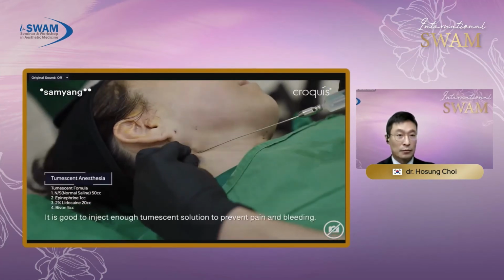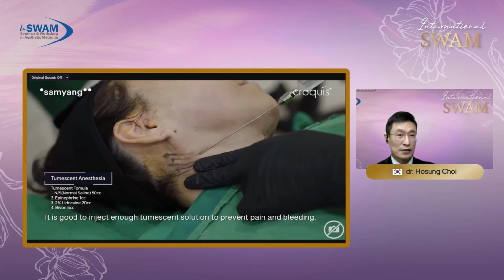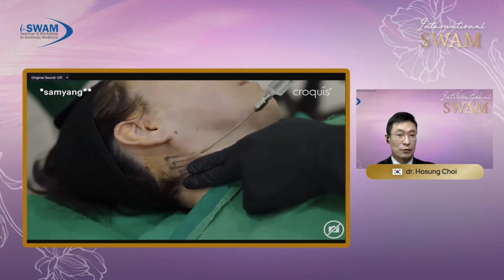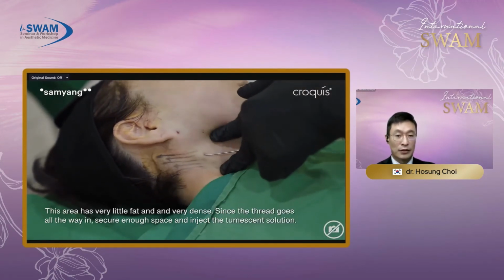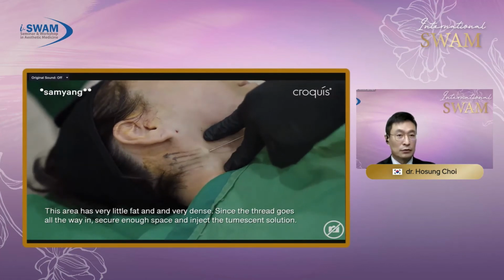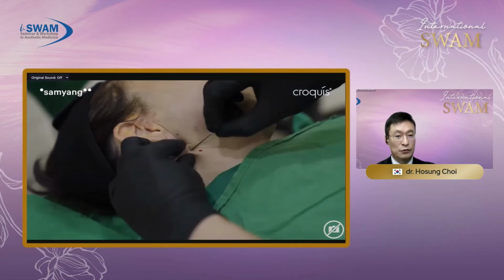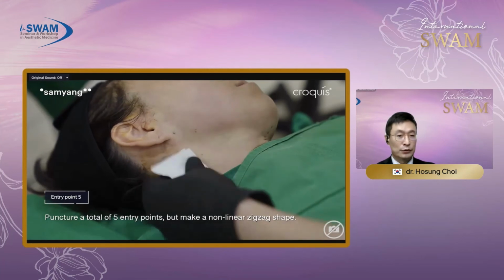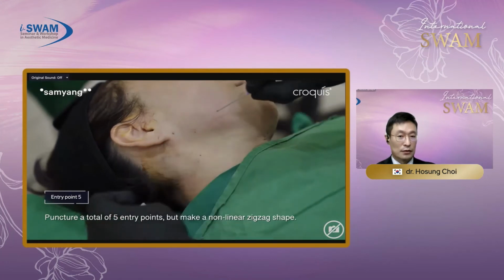Okay, the last part, I'm performing the occipital lifting technique. The skin in this area is relatively dense and tightly attached to the fascia. So it's sometimes difficult to advance a blunt cannula. So you should be very gentle and very careful when inserting the threads or the tumescent cannula for tumescent infusion. This tumescent infusion is quite helpful to make the cannula easily advanced.